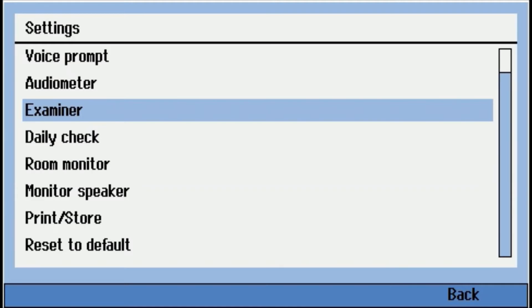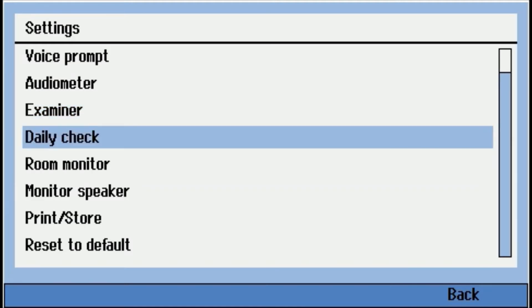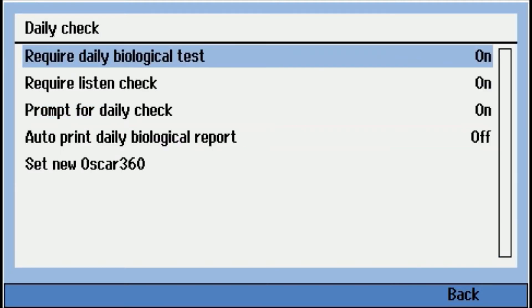Daily check. So the RA360 will store internally the last daily bio and listening check run, if you use the OSCAR 360 with it. So with the OSCAR 360, you can set this to require it. So what this means is if somebody comes in and forgets, it's not going to let the tester test people until they run those daily checks, those required checks. So you can turn this on or off.